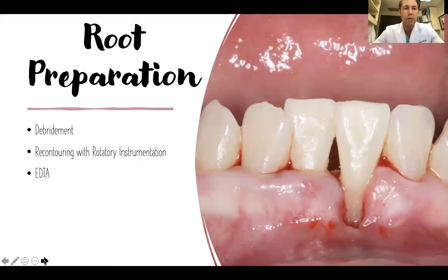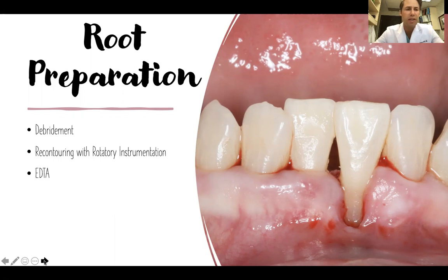Root preparation is key in any soft tissue augmentation or root coverage procedure. This involves thorough clinical debridement with hand and/or ultrasonic instrumentation, followed by root recontouring with rotary instrumentation to flatten the root surfaces and create a broad avascular surface. We then treat the roots with a chemical — in this case EDTA, a chelating agent which allows for connective tissue attachment.